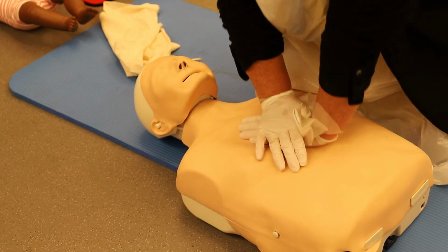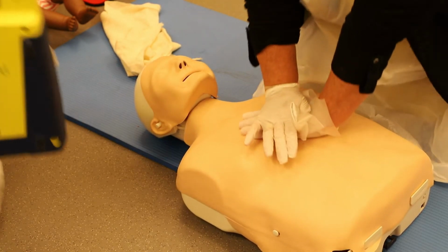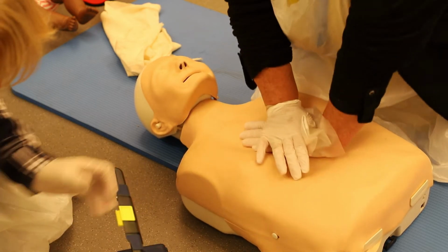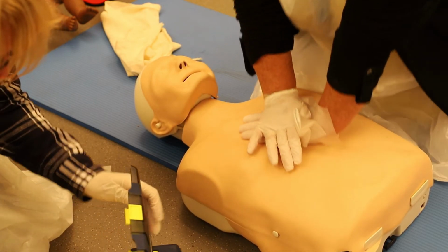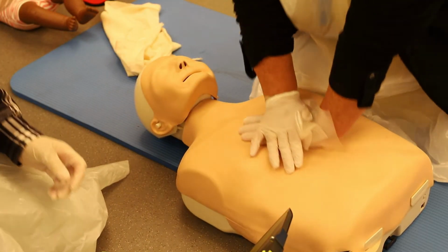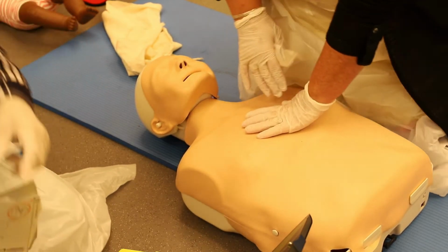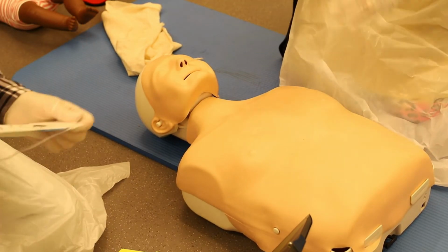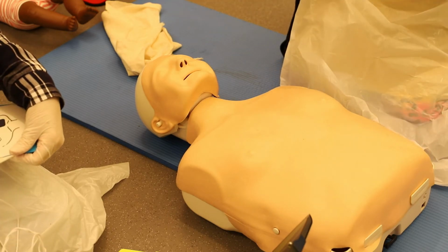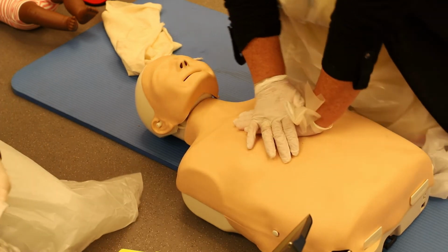1, 2, 3, 4, 5, 6, 7, 8, 10, 11, 15, 16, 17, 18, 19, 20, 23, 24, 25, 26, 27, 28. Tear open package. And remove pad. Okay, so I would continue the process of giving breaths and 30 compressions while my colleague then sticks the pads and works around me. Remove pad. Peel 1 pad from plastic liner.